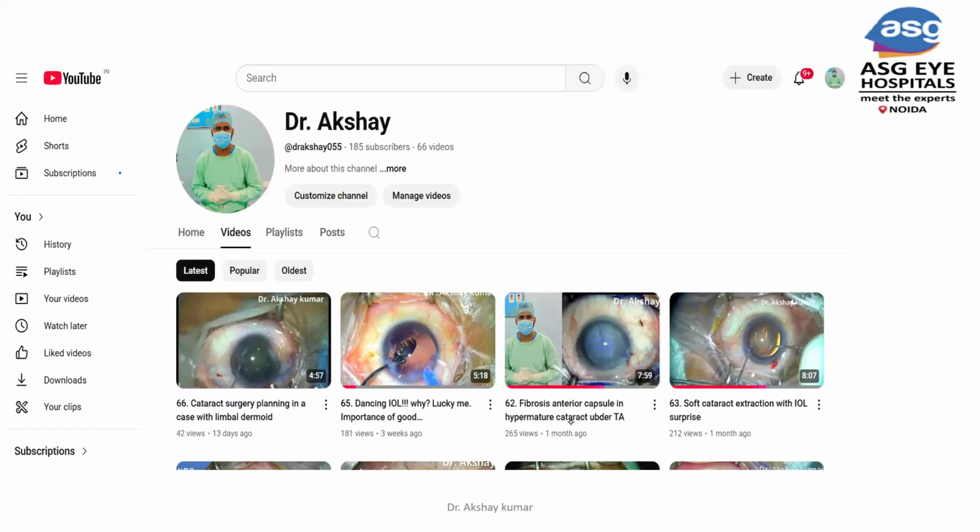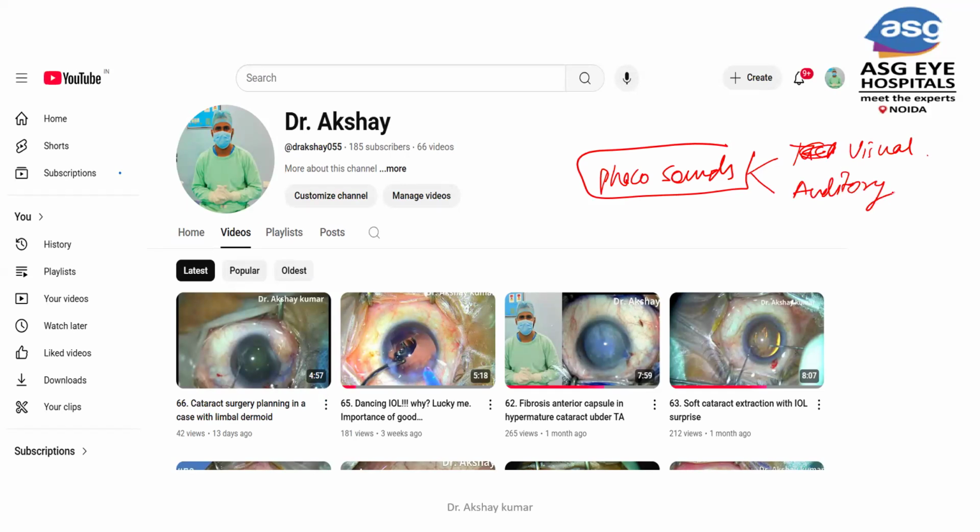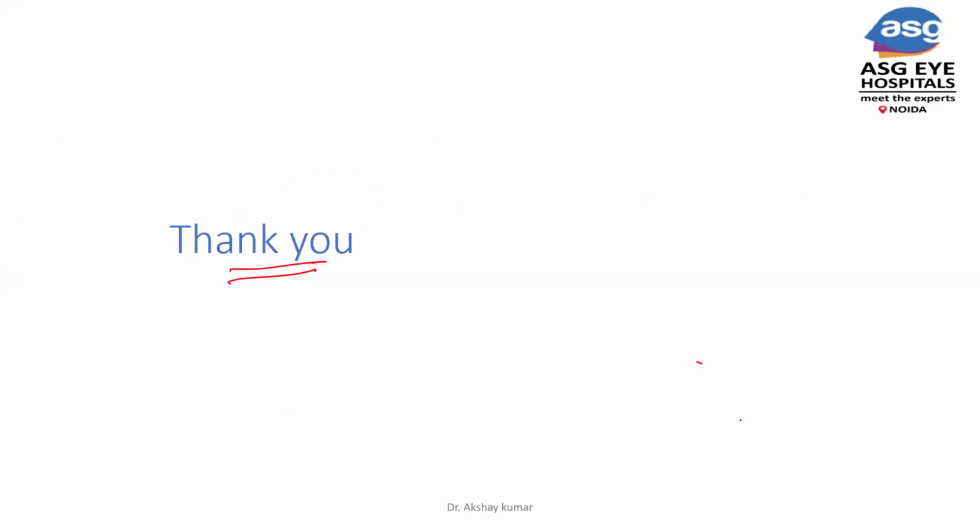So what you can do is, I have made a separate playlist for the fellows only, in which I have included only the Phaco sounds along with the video. So you can watch it again and again and look for tactile feedback, visual feedback and auditory feedback. You will be able to listen to the voice. So you will know that after occlusion what type of sound is generated, and during the aspiration and during the irrigation also what type of sound is generated. So this is it. Thank you so much.